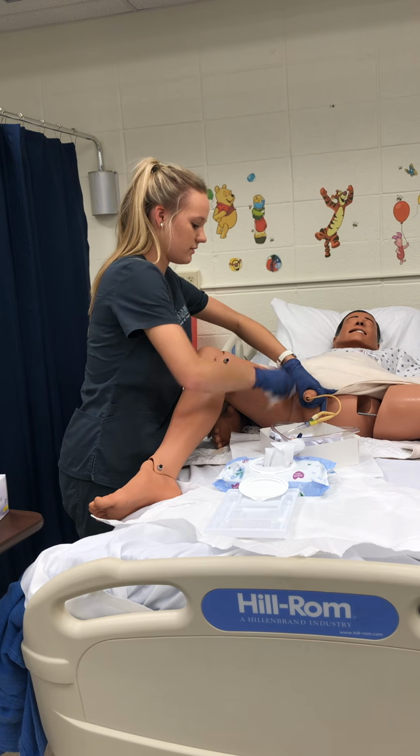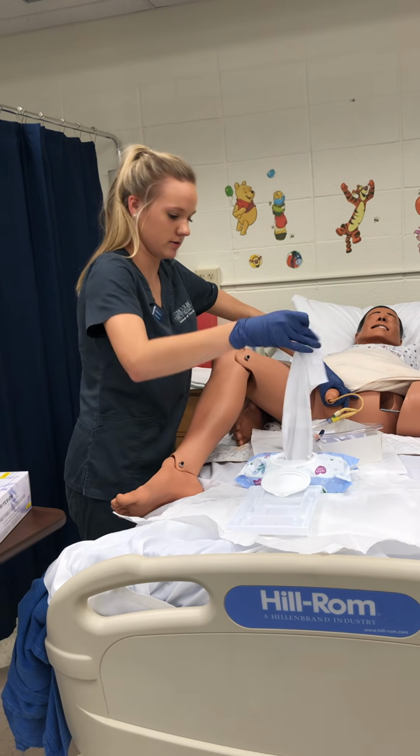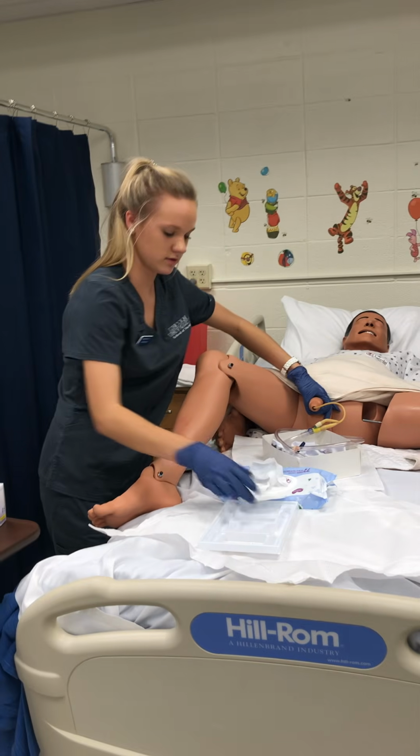No longer having to be sterile, I just don't want to mess with the catheter. Do it 3 times. Okay, clean that up.